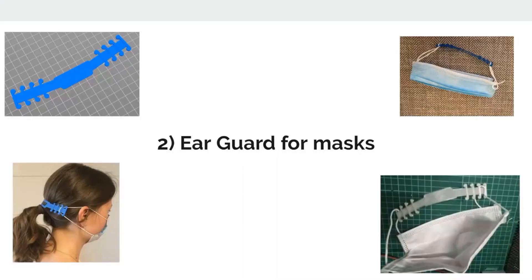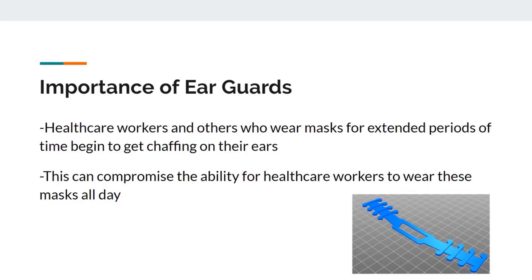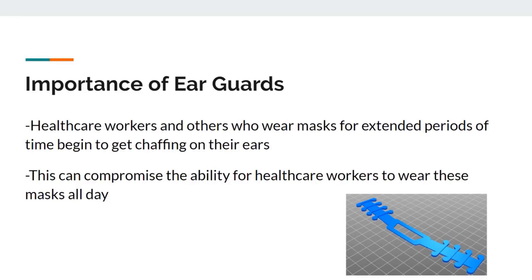Next, ear guard for masks. Healthcare workers and others who are wearing masks for extended periods of time begin to get chafing on their ears. This can compromise their ability for healthcare workers to wear these masks all day. That's why we get an ear guard.